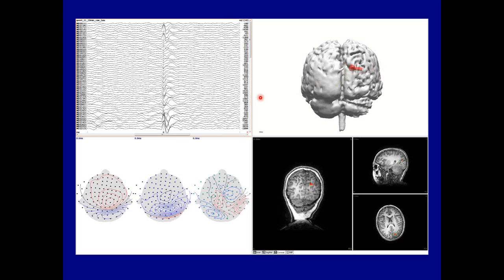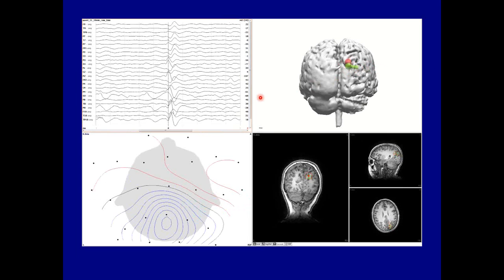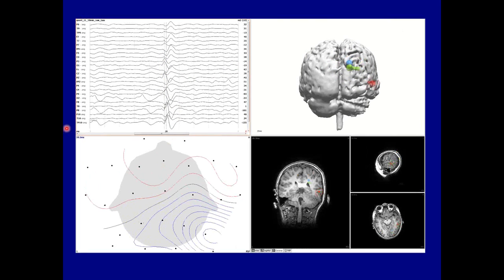The interesting thing is that his EEG spikes, if you look at the very, very first peaks of the EEG spike, it too agreed about this mesial location, but the major spike that everybody would look at out here is this radial spike suggesting a radial or lateral occipitoparietal source.